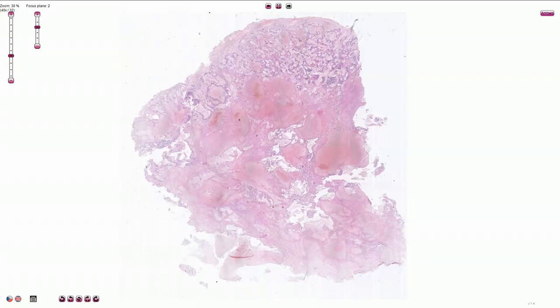Choriocarcinoma is a malignant tumor of syncytiotrophoblast and cytotrophoblast. It may be gestational in origin or non-gestational as a germ cell tumor. Gestational choriocarcinoma is most commonly associated with a complete hydatidiform mole, but can also be associated with a spontaneous abortion or with a normal term pregnancy.